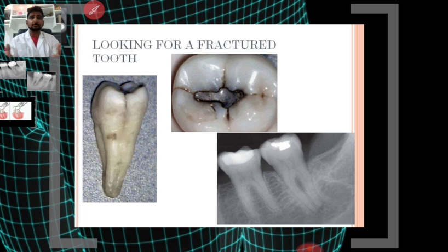And I was in shock. I was like, how can it be? The tooth is vital. Patient is having abscess. I just numbed it and it was tender and everything. How can it give symptoms of having a pulp inside the tooth? As I was proceeding, I was just exploring and I found a white line which was going from mesial to distal of this 4.